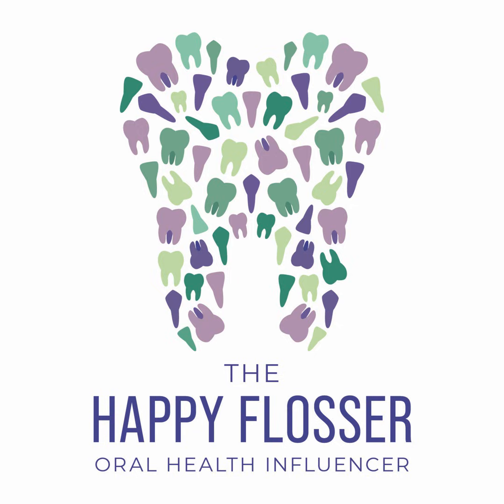That's my own recommendation to you: look at this full mouth series or x-rays that you are evaluating with fresh eyes. And then after you've done a complete radiographic interpretation, you can reference a previous set of x-rays to see if there have been any changes. Let's see if there's been progression, right? You want to check for progression, change, and stability.